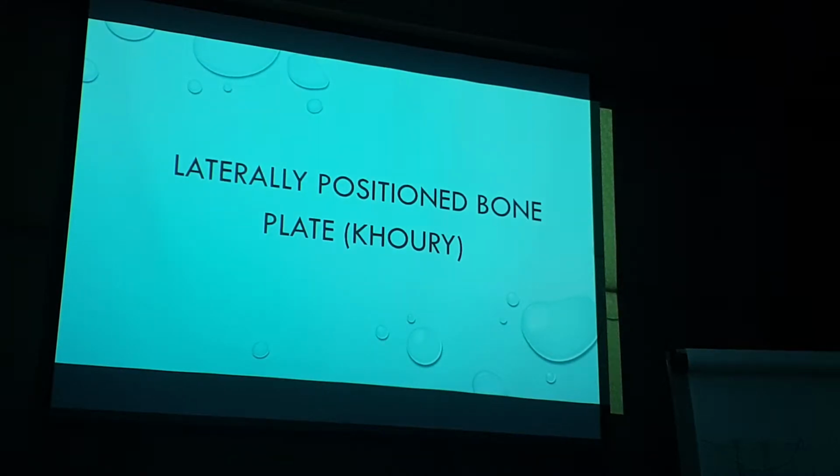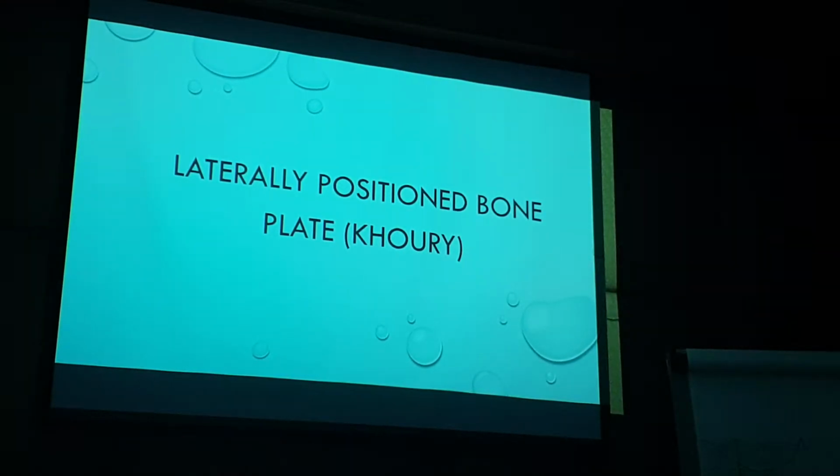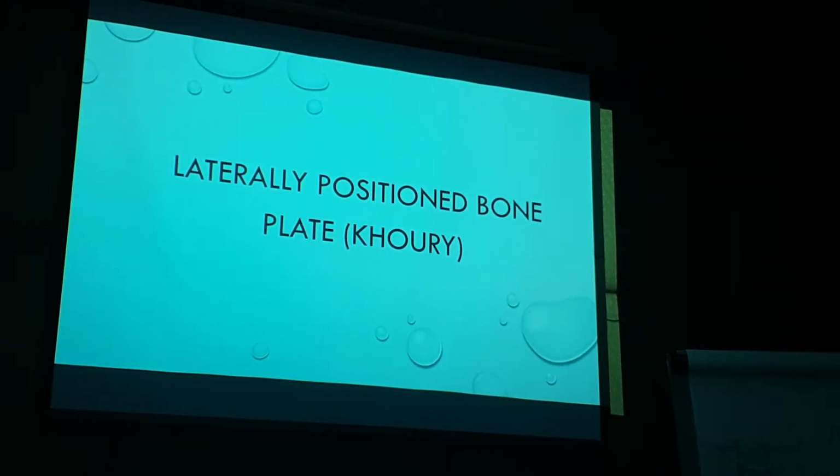Laterally positioned KHOURY bone plates. I use this more and more often now instead of cortical cancellous block grafts, and the reason for that is that I find that when bone is growing into a block graft, it only reaches a certain point, and the bone cells don't get into the last part of that, and then what happens over time is the outside of the block resorbs away. It doesn't become completely incorporated.